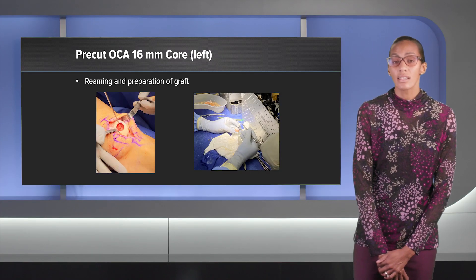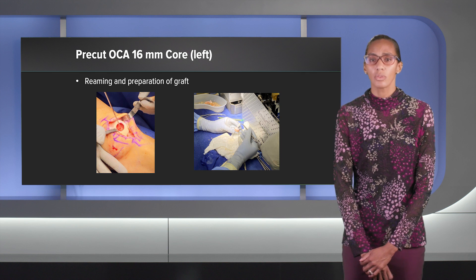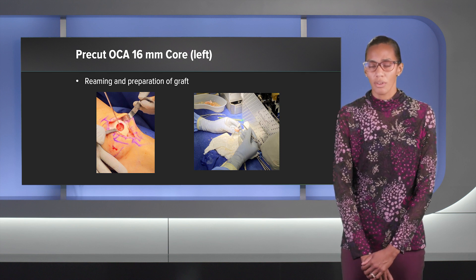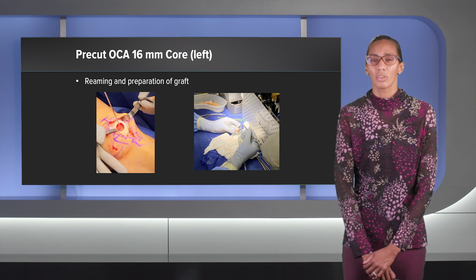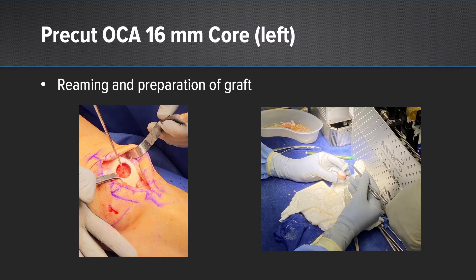With these grafts, I really take time to look at the graft before you start reaming. You really want to measure the depth of the graft, look at the cartilage, and look at the slope of the cartilage so you can match it to the patient. I take most of my time on this procedure inspecting, measuring, and examining that graft, making sure my measurements are good. Then I go ahead and ream over that central pin, usually about 9 to 10 millimeters.